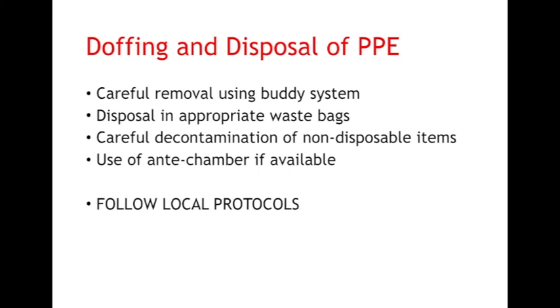The careful doffing of the PPE equipment is probably the most important stage to prevent inadvertent contamination of yourself or colleagues. It should be done according to local protocols using a buddy system. All PPE should be disposed of in appropriate waste bags, and careful decontamination of non-disposable items must be performed. If an antechamber is available, this should be used as appropriate. A further video presentation is available for the doffing method of the additional protection recommended in these procedures.